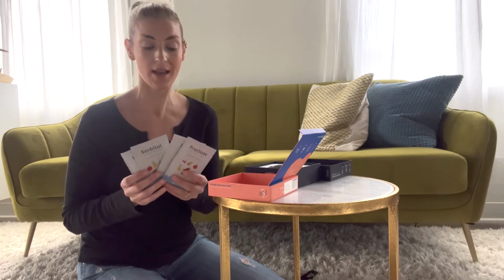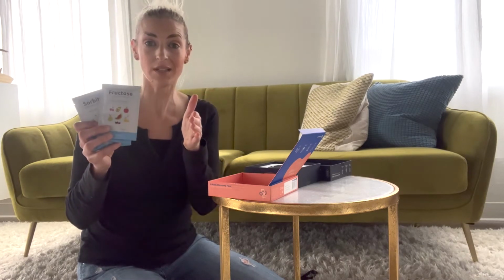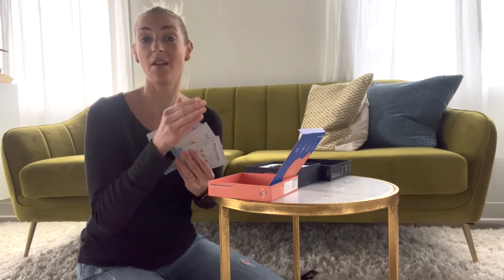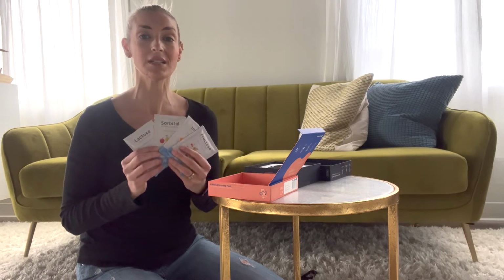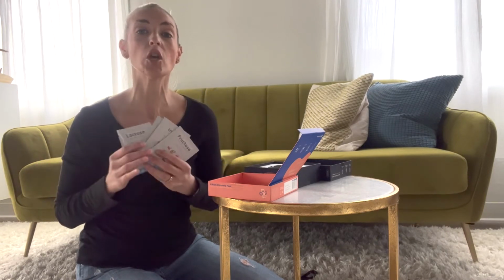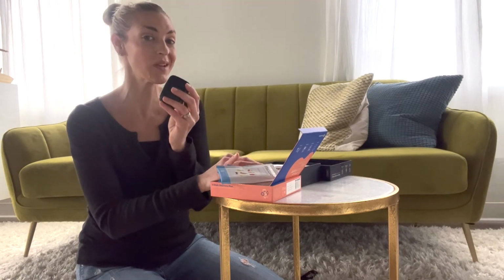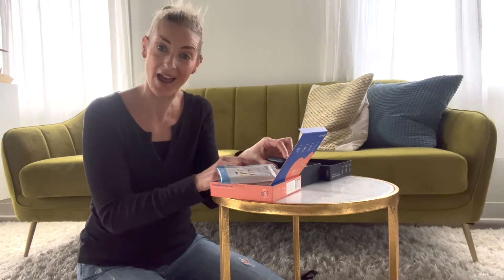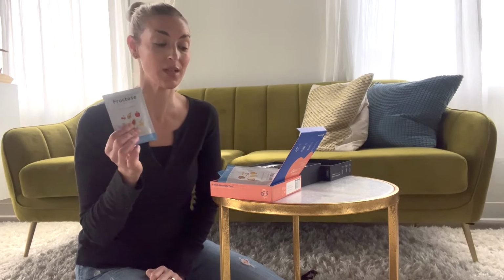The reason why is because you'll do very specific testing around each one of these categories. These would all fall within that FODMAP classification of food that I discussed and described earlier. And when you do these siloed off challenges, you will know based on your breath test reading that you will find in your app if you are reacting and at what levels and how much to these different things.